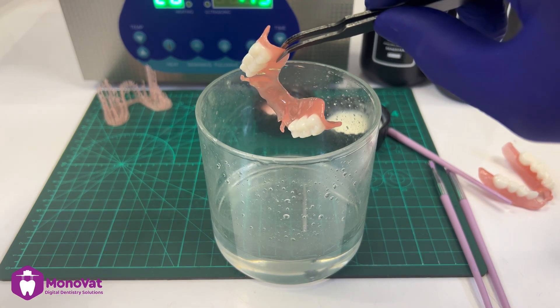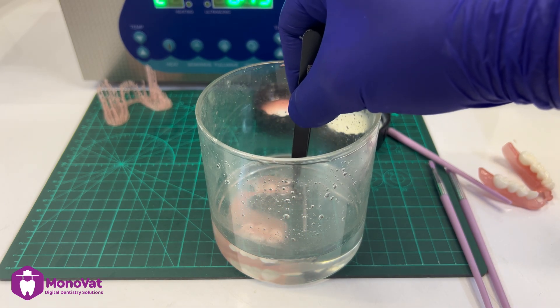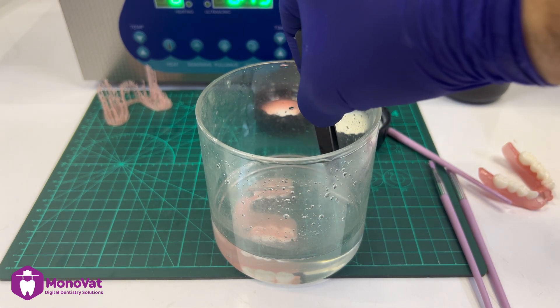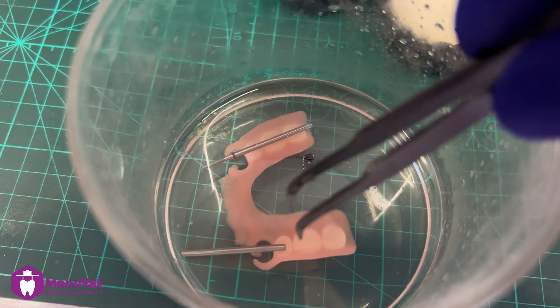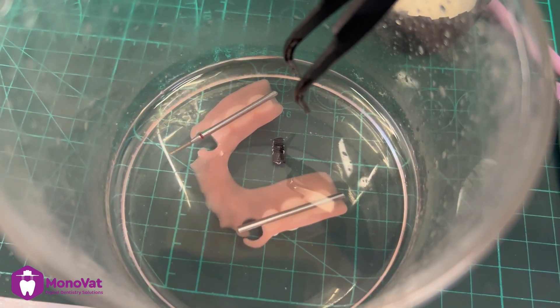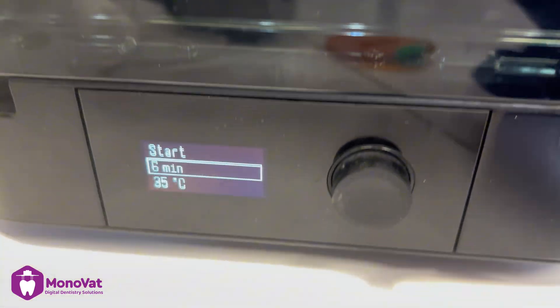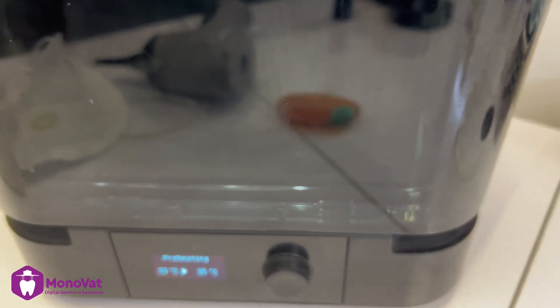After that, I will submerge the denture in a material called glycerine. This material isolates the denture from oxygen during the curing stage. Here I am adding some weights inside the denture to prevent it from floating, so all the denture should be fully submerged in glycerine. Then I put it in the cure machine again for six minutes — refer to company recommendations for your curing unit.